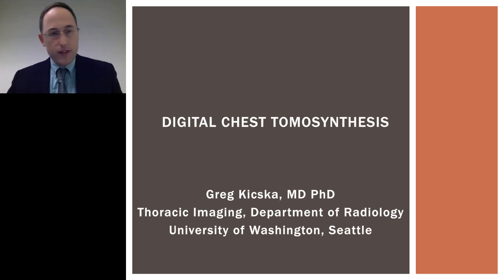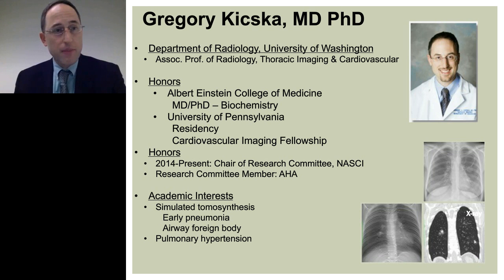So as a quick introduction to who I am, my name is Gregory Kicska. I'm an MD PhD, and I practice here at the University of Washington. I'm an associate professor in the Department of Radiology. I'm in the thoracic imaging section as well as the cardiovascular imaging section, and in the thoracic imaging section is where we do tomosynthesis. I've done a lot of research throughout the years. One of my areas of interest is actually in tomosynthesis, particularly related to simulated tomosynthesis.